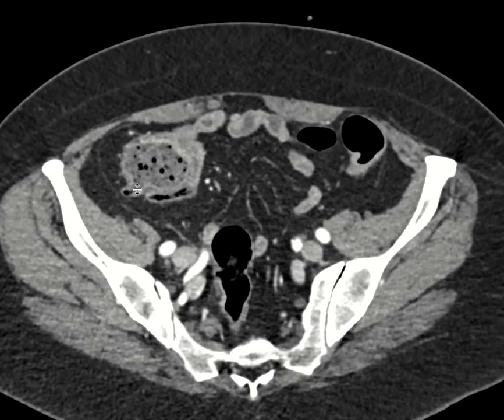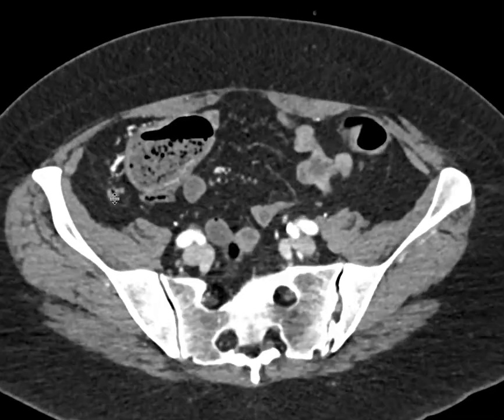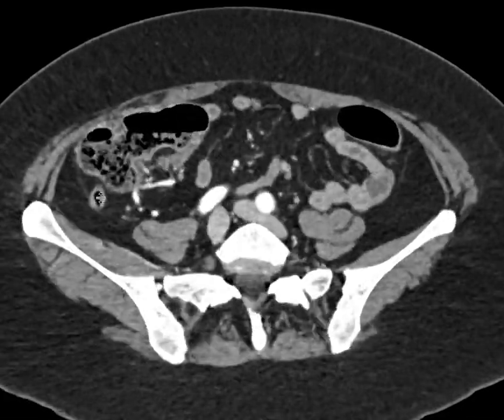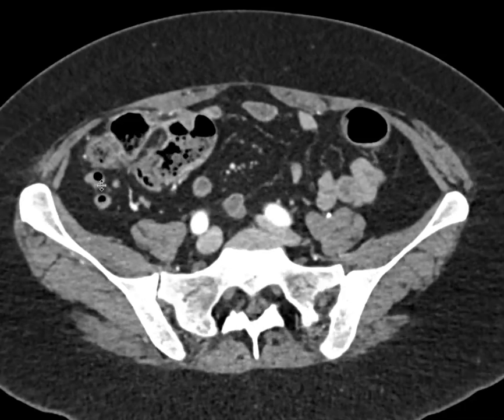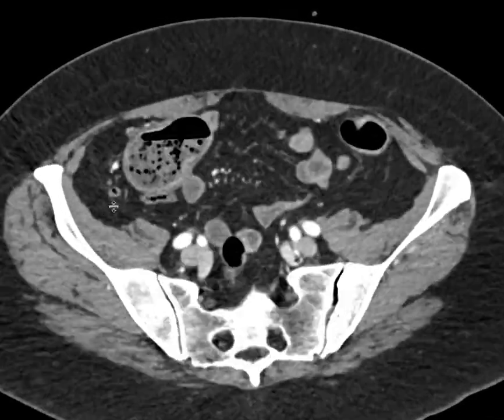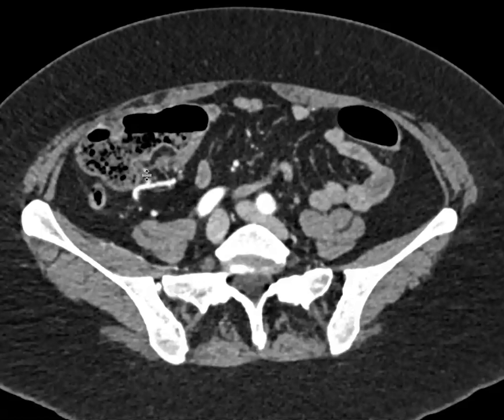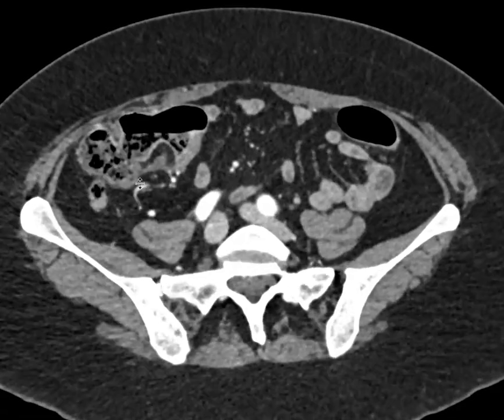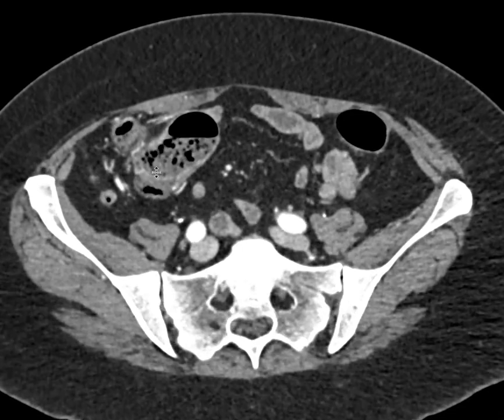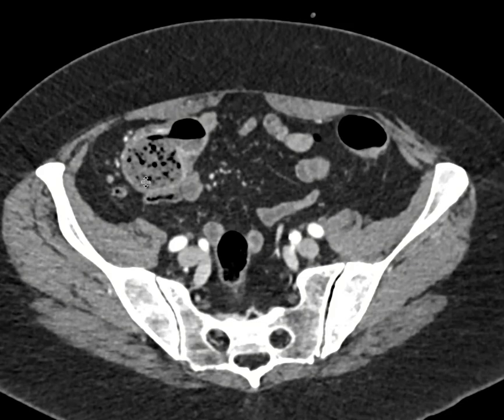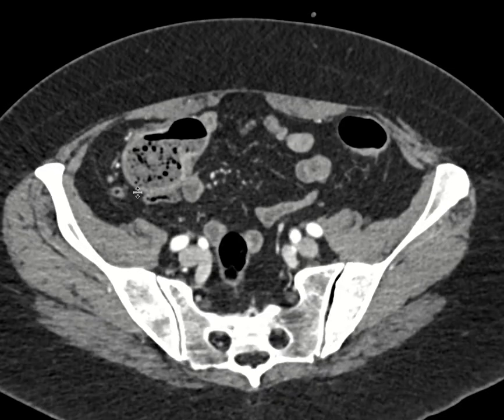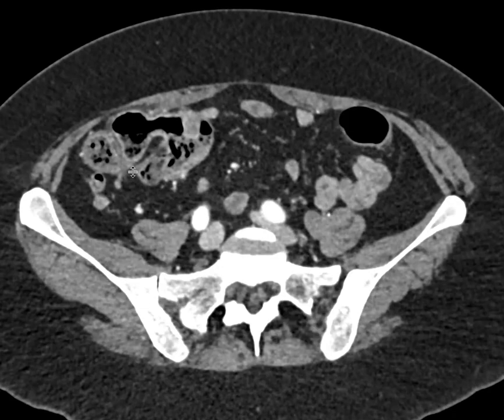Sure enough, here's our appendix coming along the right paracolic gutter and heading superiorly. This is a nice normal appearing appendix — it's got some air within it, it's not particularly thickened. That's one way to look for the appendix: you look for the ileocecal valve, and you know that the appendix is going to come off the cecum more inferiorly and on the same side as the ileocecal valve.